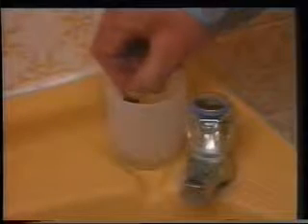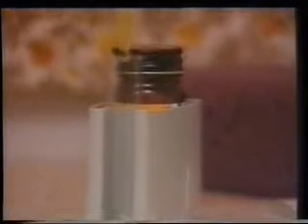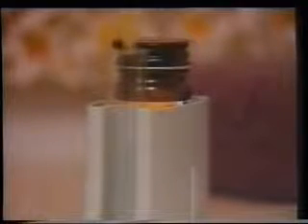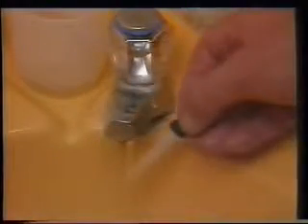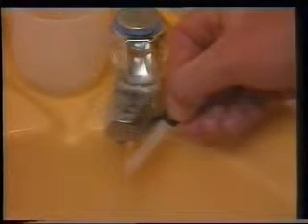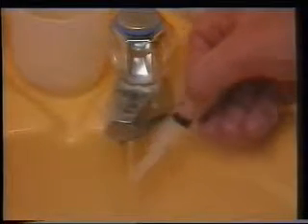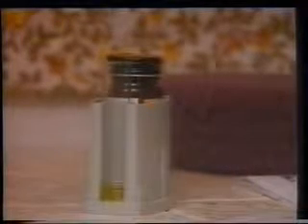The first step is to collect his urine in a clean, dry container. A small amount is then drawn up into the special Clinitest dropper, and exactly 5 drops are dropped into the Clinitest tube. Always ensure you use the correct dropper and tube. The dropper is then emptied and rinsed out several times with tap water. Then some fresh water is drawn up into the dropper. Now exactly 10 drops are added to the tube.